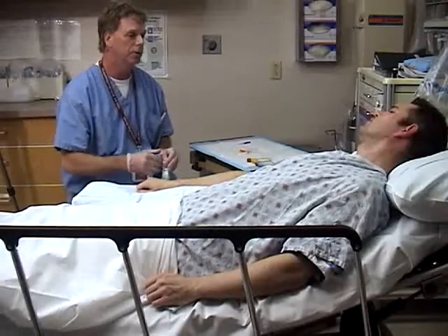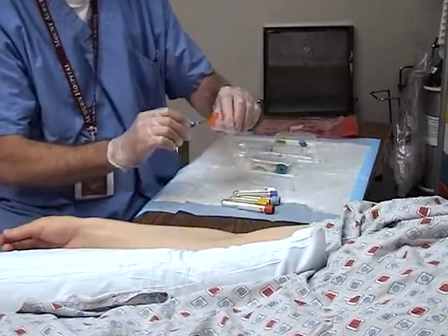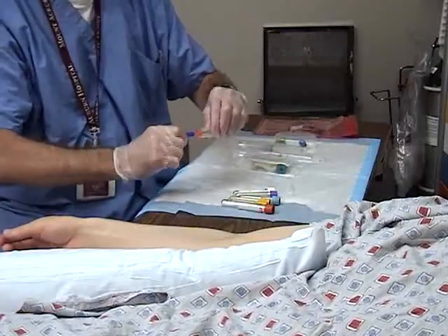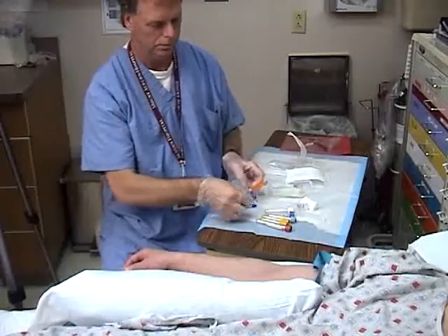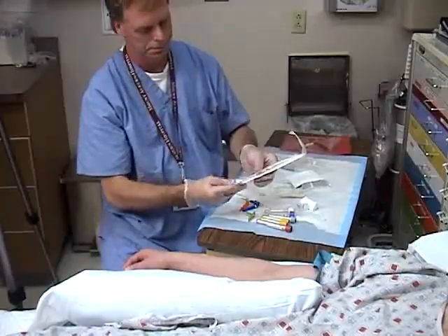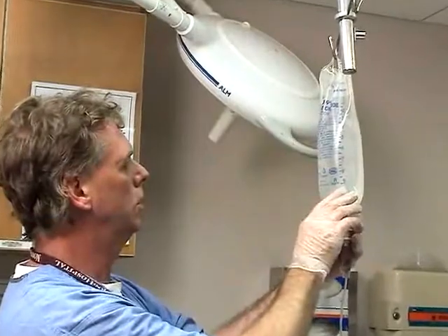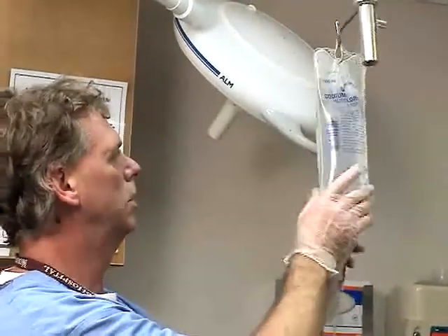Position the patient supine on the stretcher and arrange all equipment on a bedside table within easy reach. If possible, you should try to be seated during the procedure. Hang the bag of intravenous fluid on a pole and check the fluid to be administered for contents and expiration date.